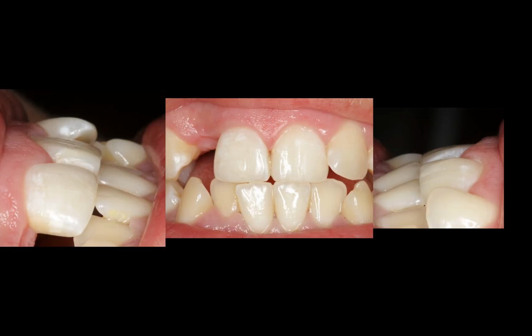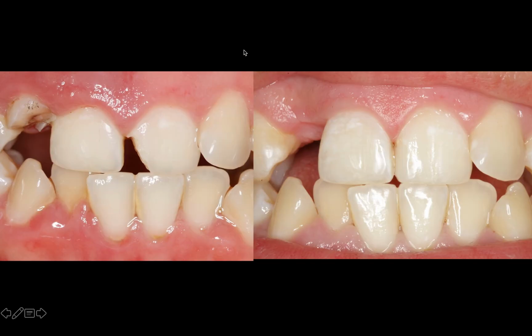Here, this is the class 4 restoration. We have it from all angles. And then here I have before and after. So again, this was that presentation date, and this is right when we completed the class 4. Patient was ecstatic with this. I was very happy. I think this was probably the best thing I did up to that point in the main clinic. And, just a lot of things to look at here.